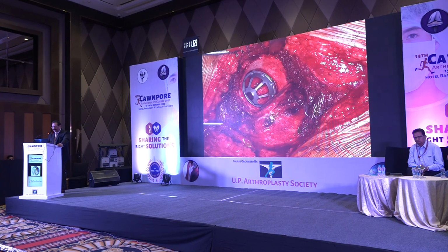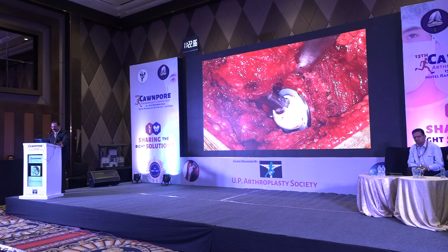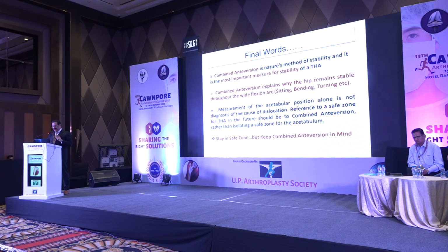Now, whenever you're putting a cup, beware of large osteophytes, which you are supposed to remove, otherwise there will be impingement. And we want an impingement-free zone in the majority of activities, which you can test on table: flexion, adduction, internal rotation, abduction, external rotation, and all safe zones you can check. So combined anteversion is nature's method of stability, and it is the most important measure for stability in the recommendation by Lewinnek and group. Combined anteversion explains why the hip remains stable throughout the wide flexion arc. So you do stay in the safe zone, but keep combined anteversion in mind.